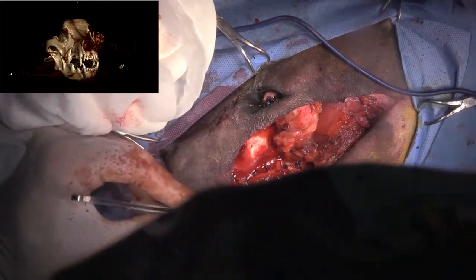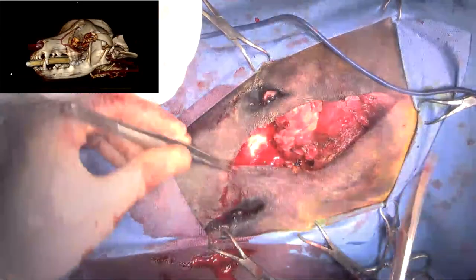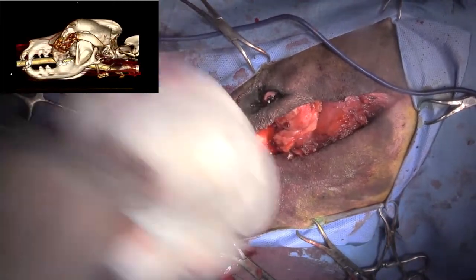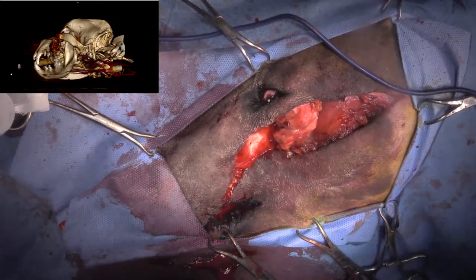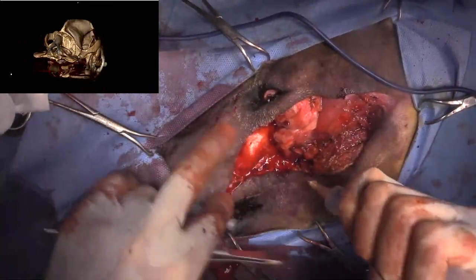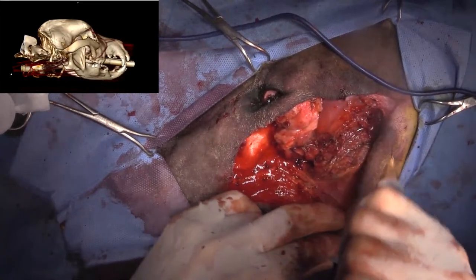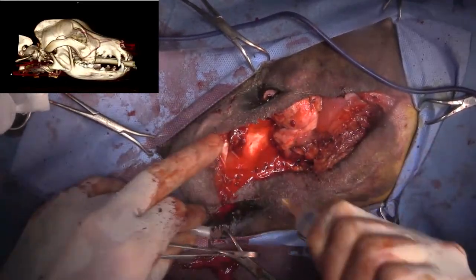So I'm just loosening up this tissue here so that we don't have as much tension on the gingiva that's closed over the maxilla. And one other question about why use mepivacaine over bupivacaine? Bupivacaine now, I think, just comes in single dose vials, whereas mepivacaine comes in a bottle, so it really comes down to convenience and expense. I don't think we've been able to get bupivacaine for a little while.